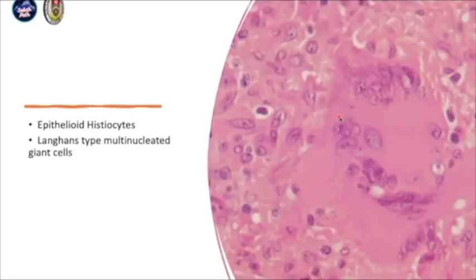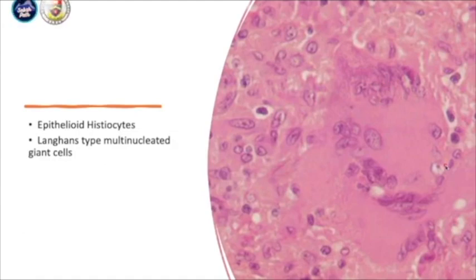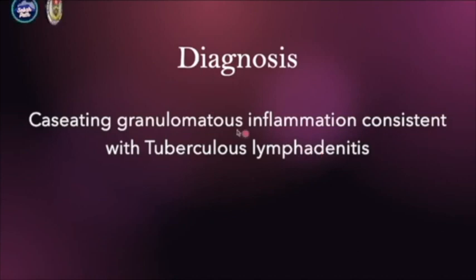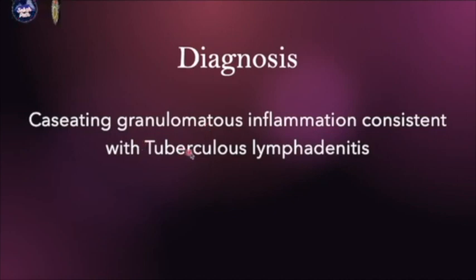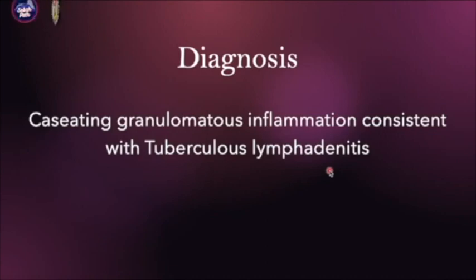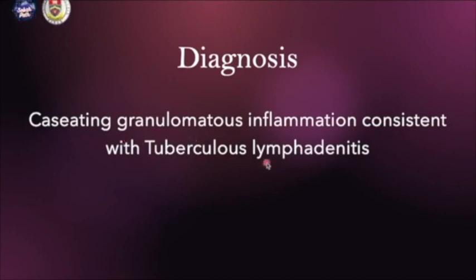And within this granuloma, you can see a Langhans-type multinucleated giant cell. Usually this giant cell has the multinucleated area in the periphery and a clear area in the center. So this is the characteristic of caseating granulomatous inflammation or caseating granulomatous lymphadenitis, consistent with tubercular lymphadenitis in this region. But the gold standard of diagnosis is still preferably either molecular technique or culture. Histologically, most of the time it is caused by tubercular lymphadenitis.